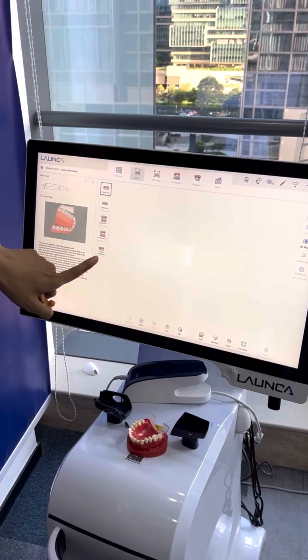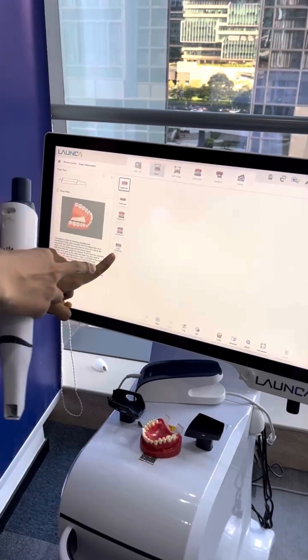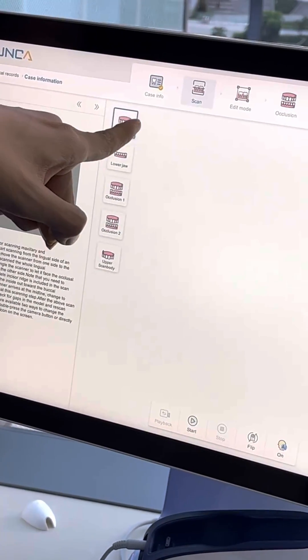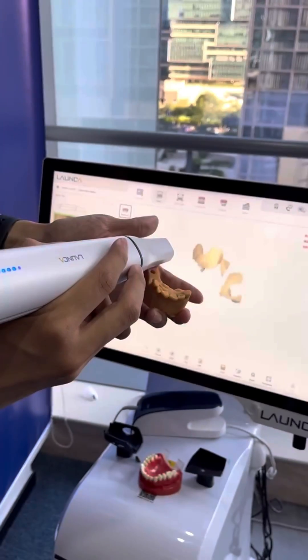You will have an extra step. You can see closer — there's the upper implant scan body. For this part, you're going to scan with the gingiva like this to give you the idea.